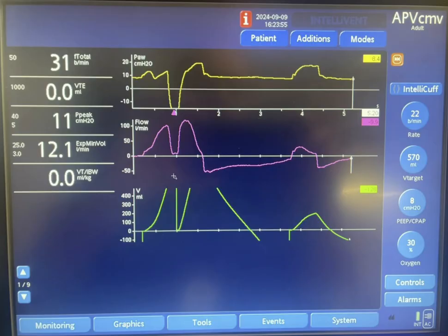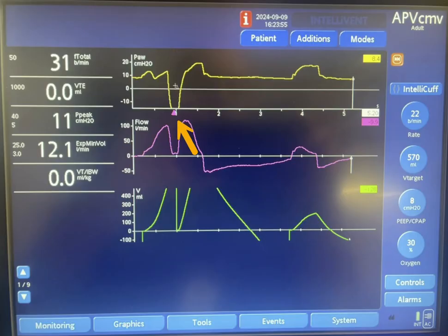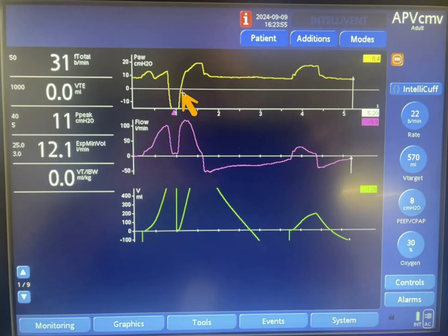Expiration starts here and the pressure is released, but you can see that the patient continued to drop this pressure below the baseline — probably down to minus 13 centimeters, then dropping further to minus 16 or minus 17 centimeters of water. That drop in pressure was enough to trigger the ventilator again, producing a second breath. You can see there is no expiratory flow at all.